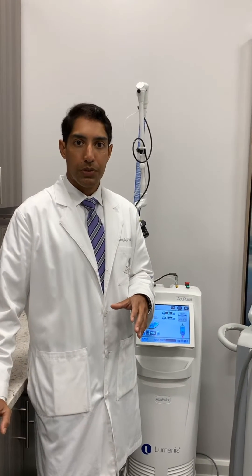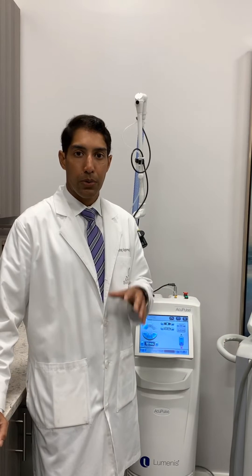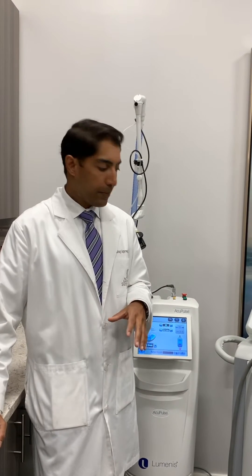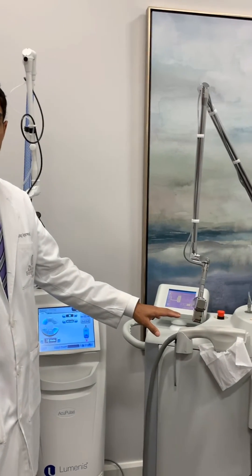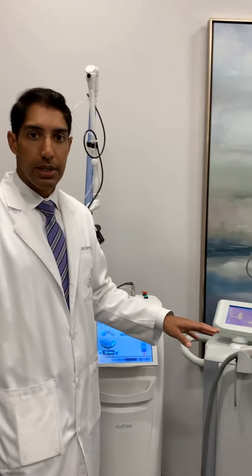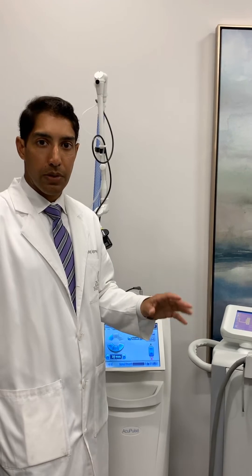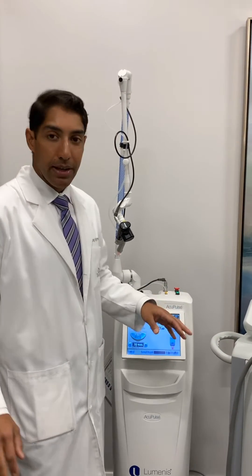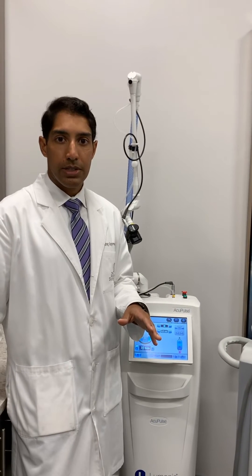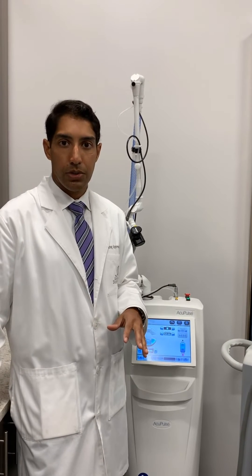We're here to talk about laser resurfacing today, and I'm going to go over our three workhorse lasers in our practice. First we have the Erbium laser, which is used for more superficial resurfacing and removing blemishes and improving fine lines and wrinkles. And then in our AcuPulse machine we have both a fully ablative CO2 laser and a fractional CO2 laser.